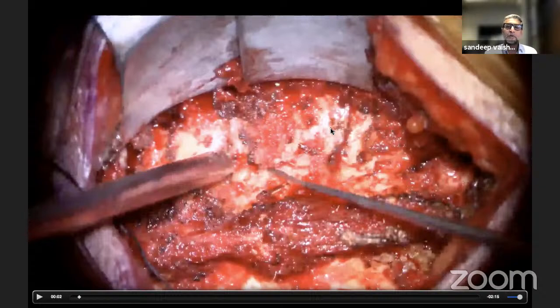So it makes a sort of cross sign. So somewhere here, this would be the center of the lateral mass. Many people take this center as the entry point. I tend to go a little bit medial, a little bit inferior to that. And I'll tell you my reason later on.